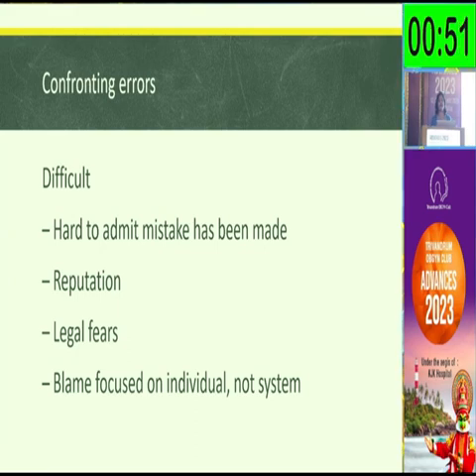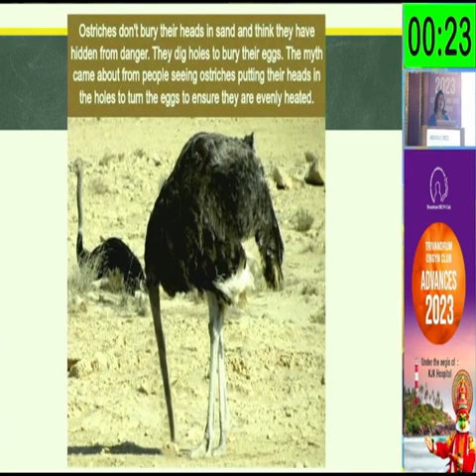And yes, when our patients are involved in this, it's very difficult to accept. For example, you've dropped the dish, or you don't find the cryolog, or sometimes transfer the wrong embryos or use the wrong semen. It is very important to address it to ourselves and address it to the patient. Yes, our reputation is at stake, and legal problems are at hand. But it is something that we need to be always looking at.